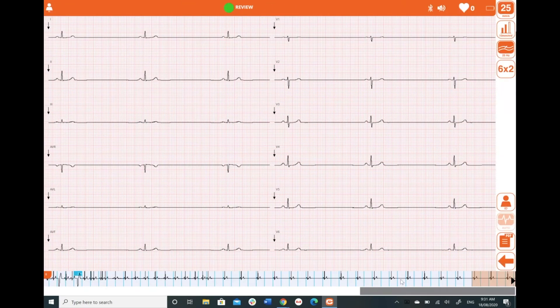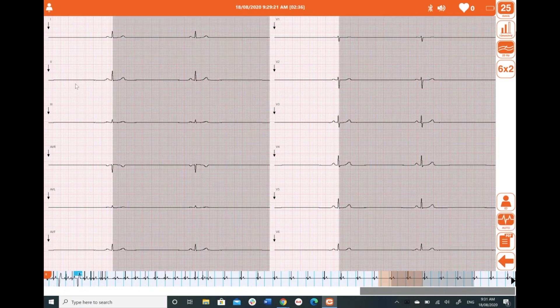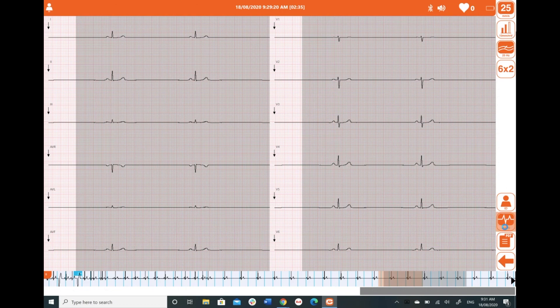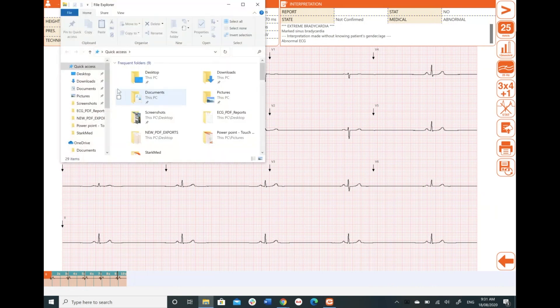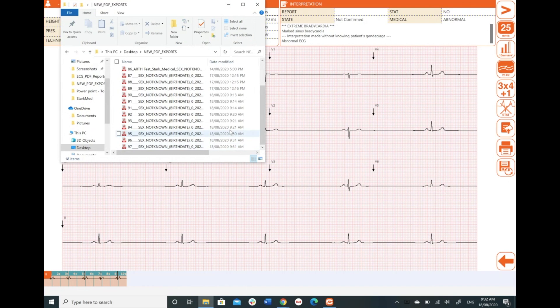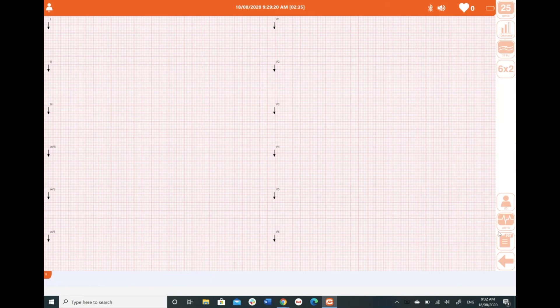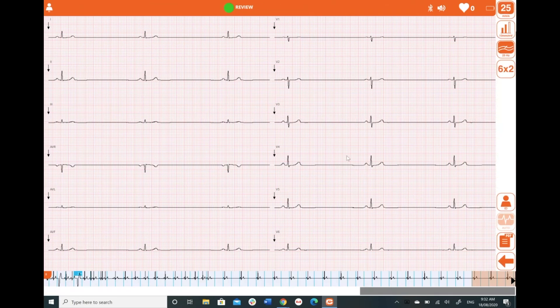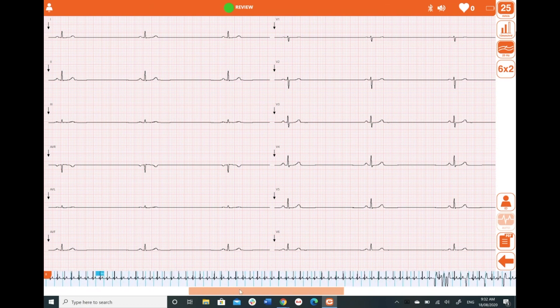Finally, I right-click to get the orange panel across, left-click to highlight the gray panel for my report, hit auto, and I have all my reports. The PDF pathway we set up before — if we scroll down here, you can see all three reports timestamped to when I took them. We can enter a patient ID as well. Hopefully that helped you with a better understanding of how to customize this software to your needs and the features of this device. Thank you so much.